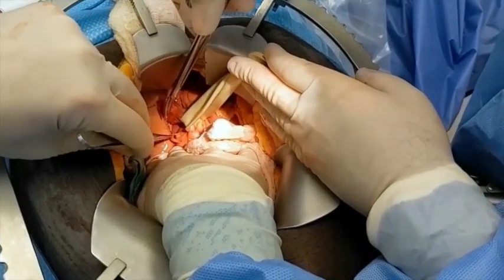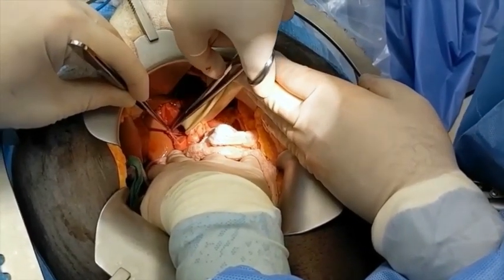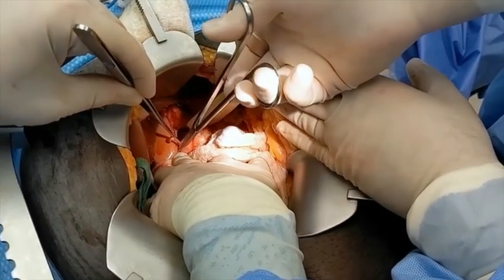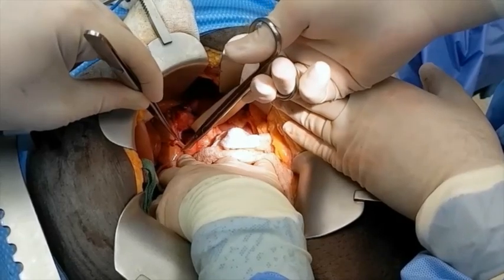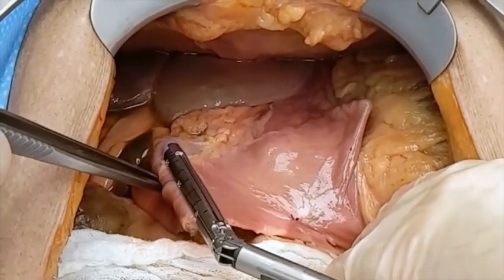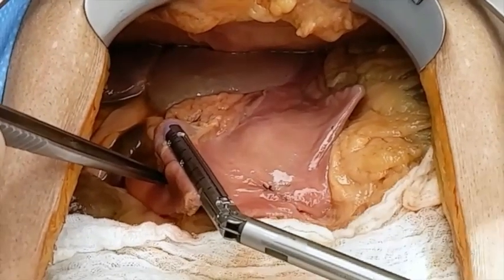A vessel loop is then passed around the posterior vagus and used to aid in medial retraction. Once again, the vagus is clipped proximally and distally, and the segment of vagus between the two clips is excised and sent to pathology. Once the vagotomy is complete, the surgeon's attention turns to the antrectomy portion of the procedure.